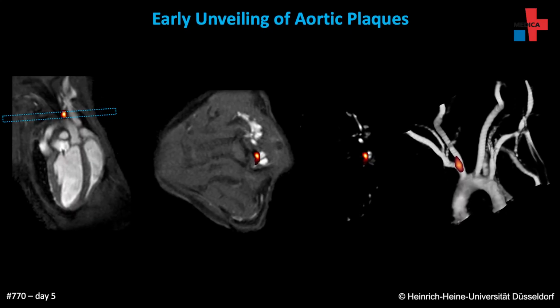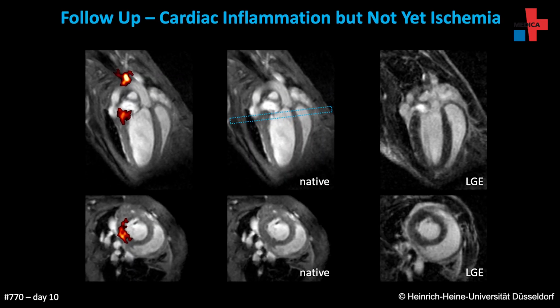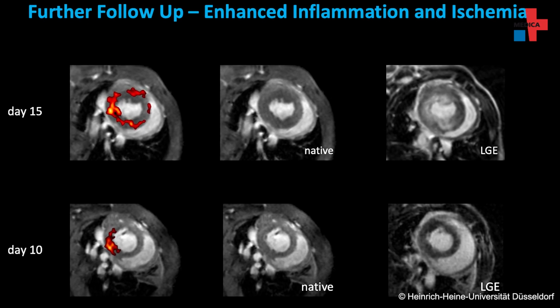And this is what it elegantly can image, and not only because it is very specific and we can image the specific inflammatory foci, it can image beyond inflammatory foci every pattern we would like to image. There has to be development, aiming at having an image of anatomy and functional tissue information and properties within a few minutes. So MRI is a very attractive platform because it is very abundantly available.